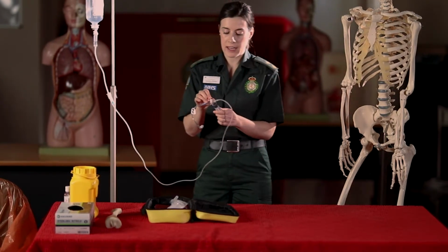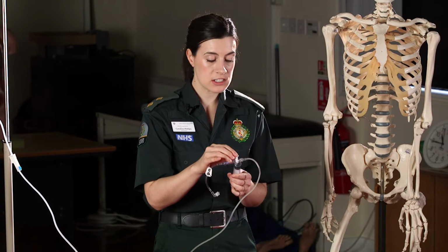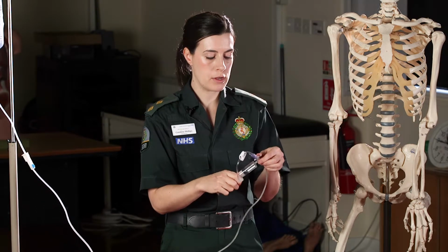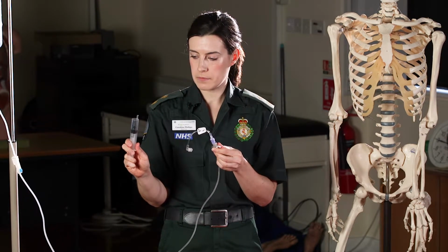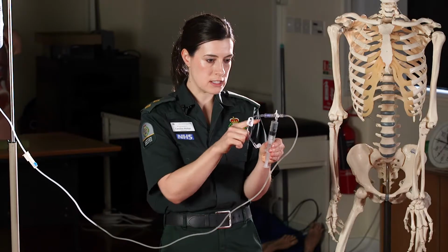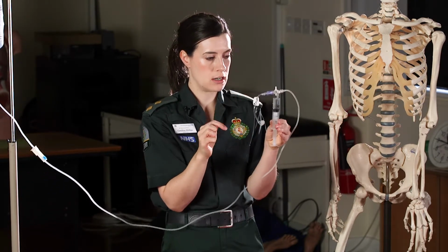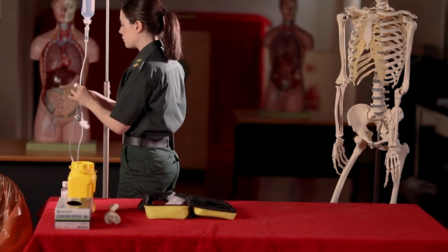The most important thing here is to make sure there's no air in the set. So if there is air, that's okay. We'll just draw up a little bit more fluid and then remove the bubble from the syringe. And I'm satisfied now that there is no air anywhere along this line, in the 3-way tap, within the right angle connector or within the syringe. So that's primed and ready to go.